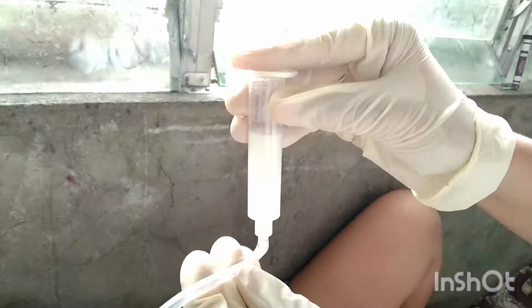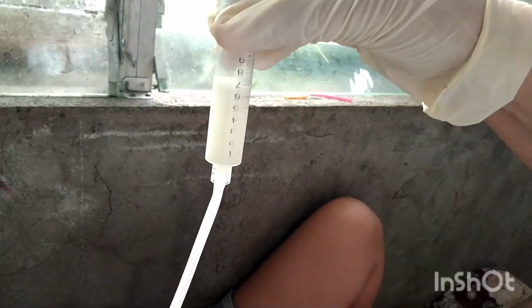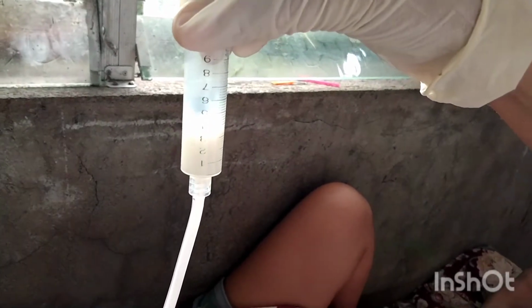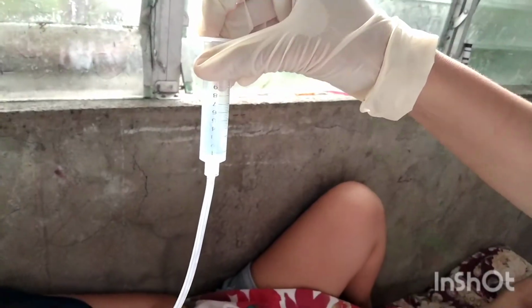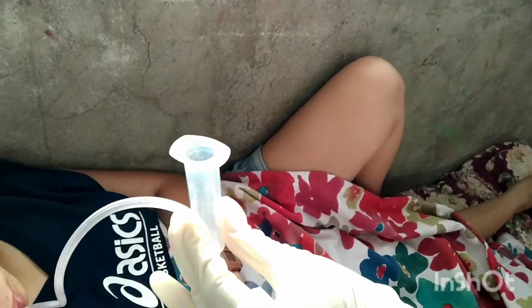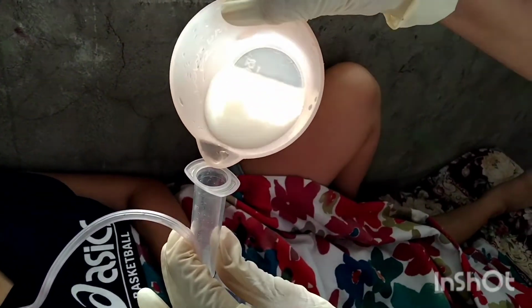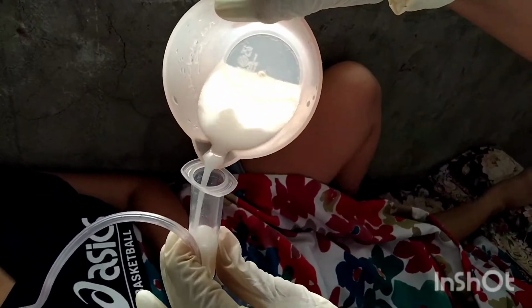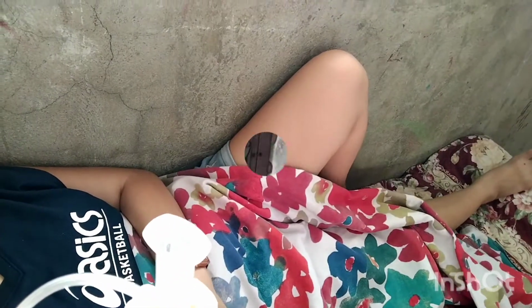If feeding bag is used, hang feeding bag on an IV pole. Fill bag with prescribed amount of formula and allow bag to empty gradually over at least 30 minutes. Gradual emptying of tube feeding by gravity from syringe or feeding bag reduces risk of abdominal discomfort, vomiting or diarrhea induced by bolus or too rapid infusion of tube feedings.